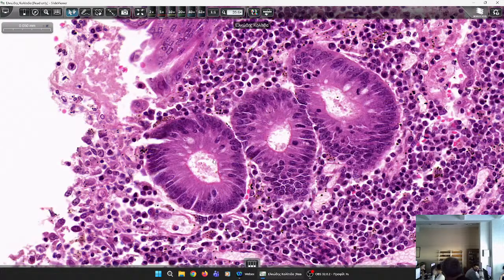Give the medicine so that the activity of the inflammation leaves. And you perform another biopsy. If these epithelial alterations remain, it was dysplasia. And when dysplasia is of high grade, then it may lead to cancer. So you could think that the patient may benefit from a prophylactic colectomy.